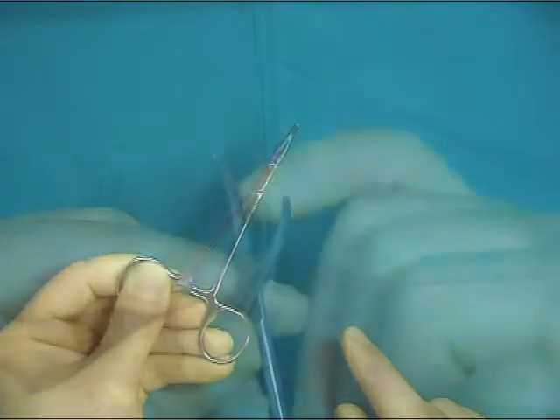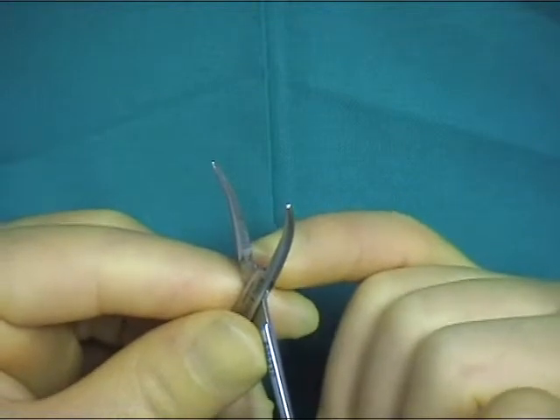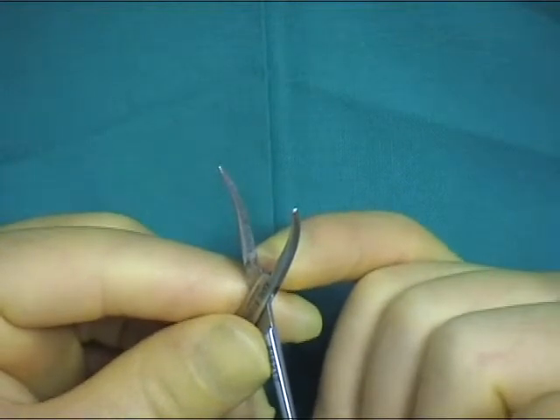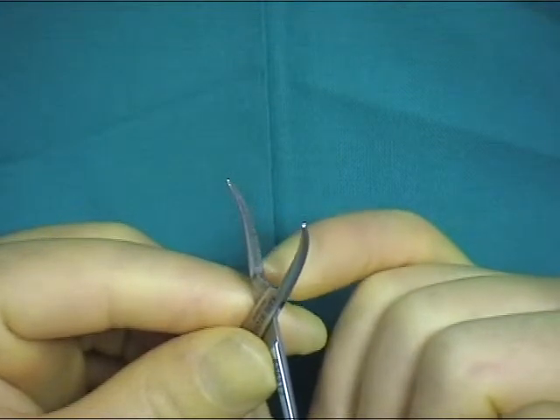Be aware that although most hemostats have serrations over the entire area of the jaws, there are some, such as Spencer Wells, where the serrations do not go all the way to the hinge end of the jaws.